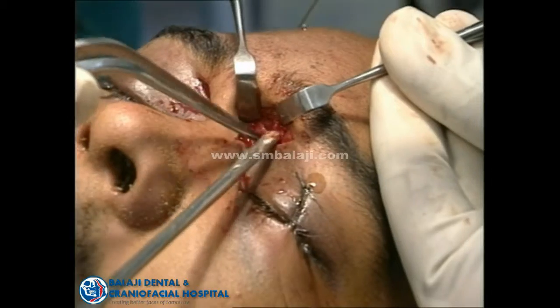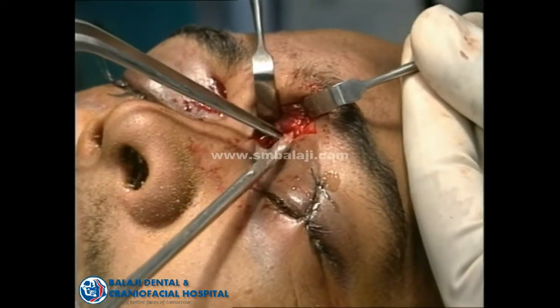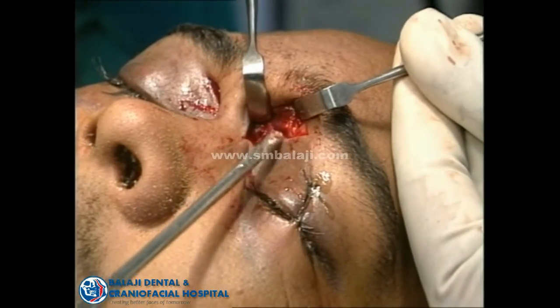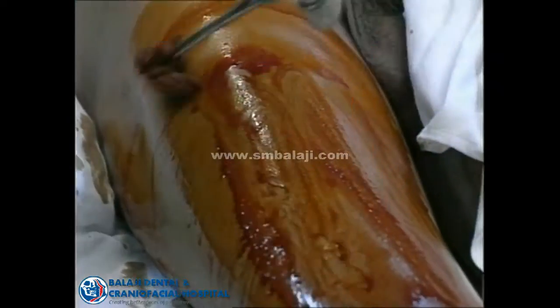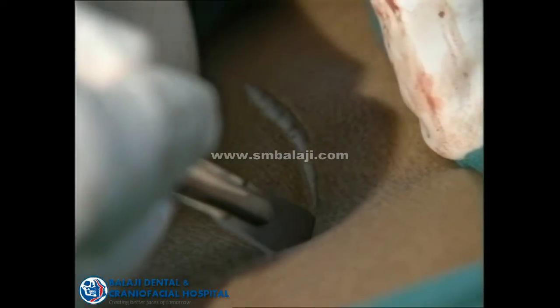I am doing wound debridement and whatever bone pieces are in the sinus need to be cleared nicely. The next step is to pack the sinus with fat or fascia.